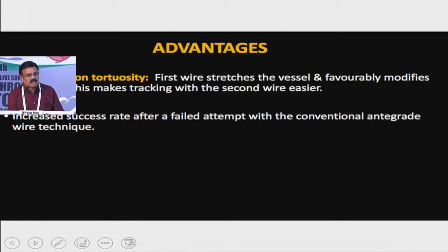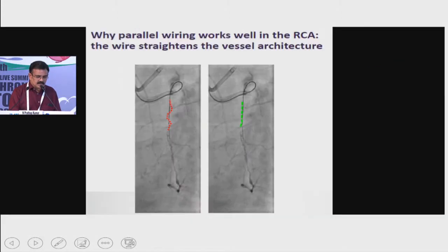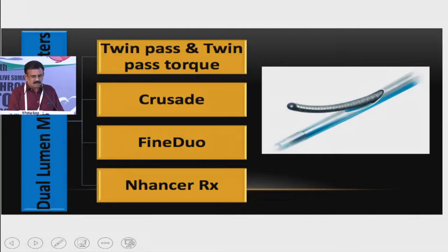So the advantage is actually intra-occlusion tortuosity. When your first wire stretches the vessel and favorably modifies the curve, this makes the tracking with the second wire easier. So the increased success rate after failed attempt with the conventional antegrade wire technique is also there. For example, in a RCA CTO, with this parallel wire technique, you have a wire, and the wire will stretch the vessel and make it less tortuous, then your second wire will have an advantage. That is another advantage, especially when you have an RCA CTO with tortuous anatomy, you can take a second wire and make it parallel.